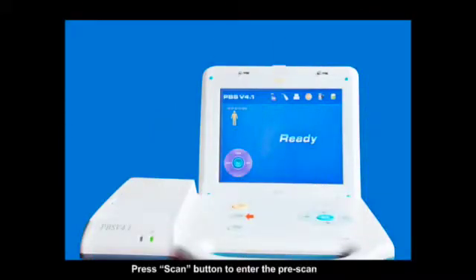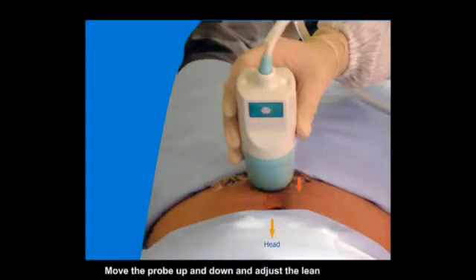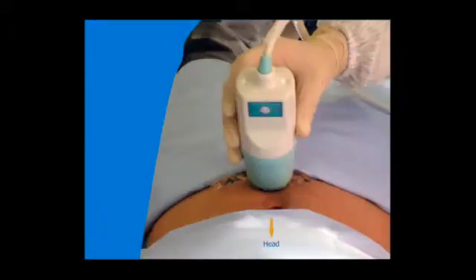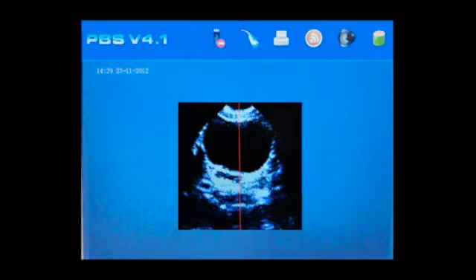Press the scan button to enter the pre-scan mode. The bladder image will be displayed. Move the probe up and down and adjust the angle of lean slowly. Maximize the dark space of the bladder volume. Move the probe left and right slowly. While the dark space is in the middle of the sector, moderately press the probe until the image is displayed clearly. Keep the probe steady.